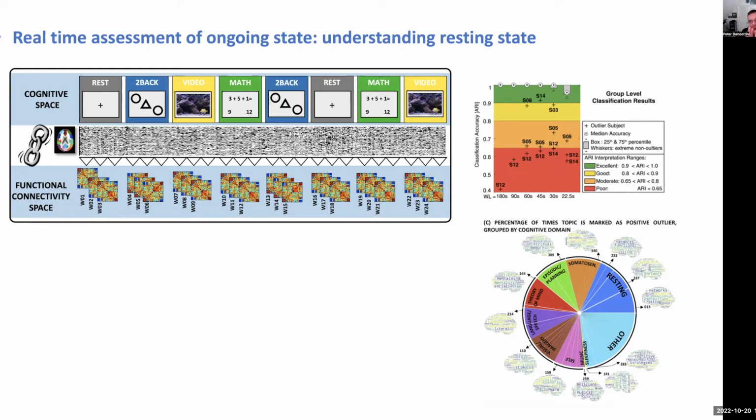We have to try to do deconvolution and then compare those maps with Neurosynth, for instance, and say, oh, it's likely reading or likely thinking about memory or something like that. So we tried to do this. It was ambitious, probably too ambitious, but we were able to divide the whole time series into probabilities of these various periods going on.